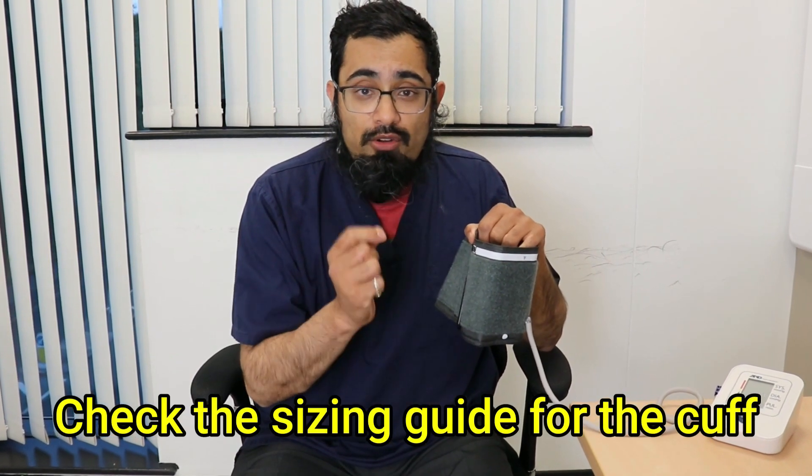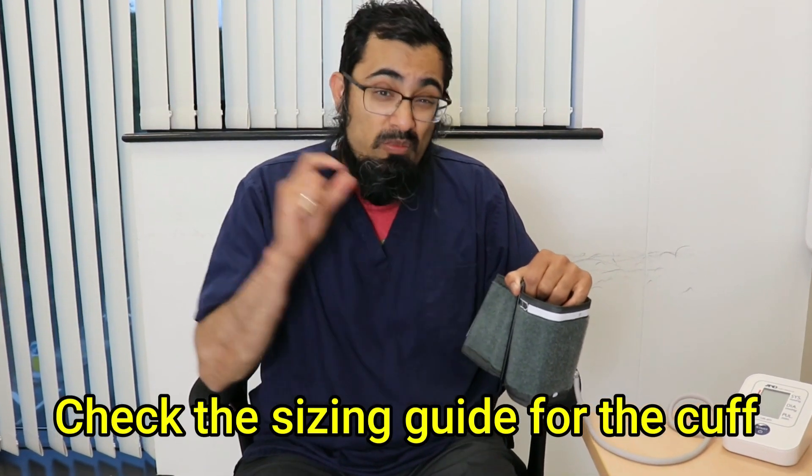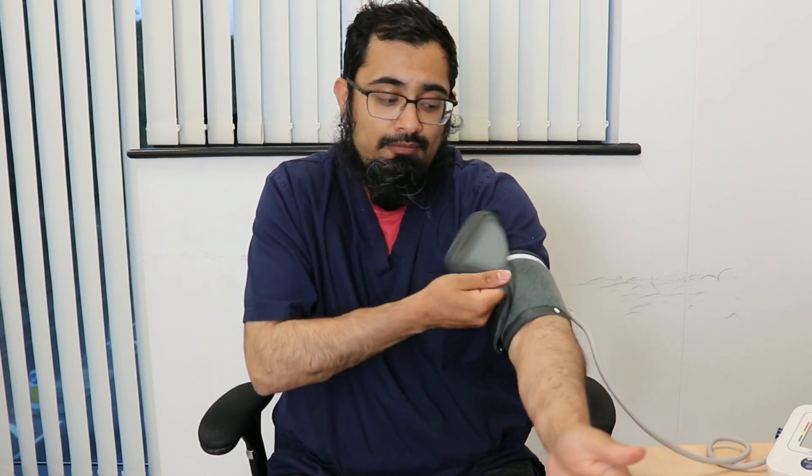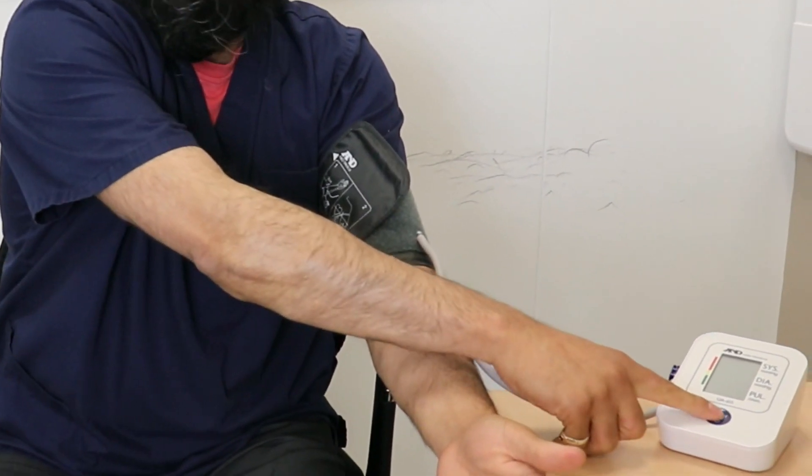Most machines have a sizing guide on them — make sure you've got a cuff that is the correct size for your arm. You may need a larger one if you have bigger arms. Then simply place your arm inside the cuff and line up the relevant sizing dot to the right place. For example, on this one the white dot should be on the middle of the arm. Tighten the cuff, make sure it's still in the right position, and then simply press the start button to go.